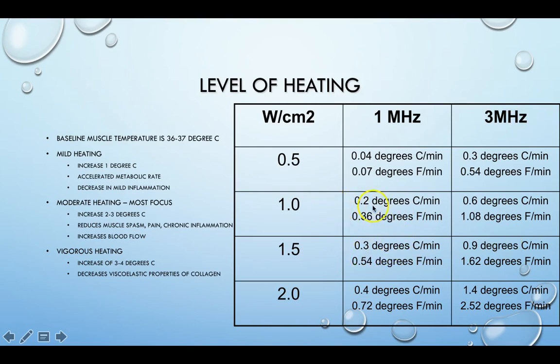So if we were trying to target deeper into the tissue, maybe somewhere in the quadricep, and we were using our 1 megahertz, that would determine our depth. And then we would want to set our intensity based on our goals, based on what our BNR says, right? Because we don't want a BNR that gets too high. So again, if our BNR is a 6-to-1 ratio, somewhere in our beam we would end up with peaks up near 12, right? So 6 times 2, 12 watts per centimeter squared, which could be potentially dangerous to the tissue. So we would maybe stay down here a little bit more.